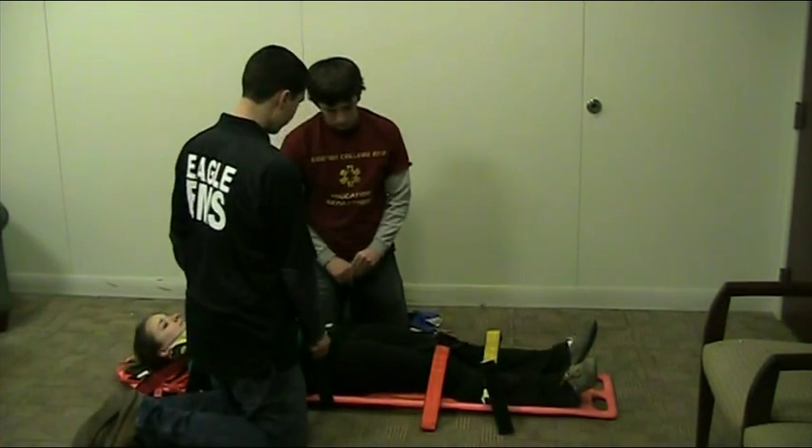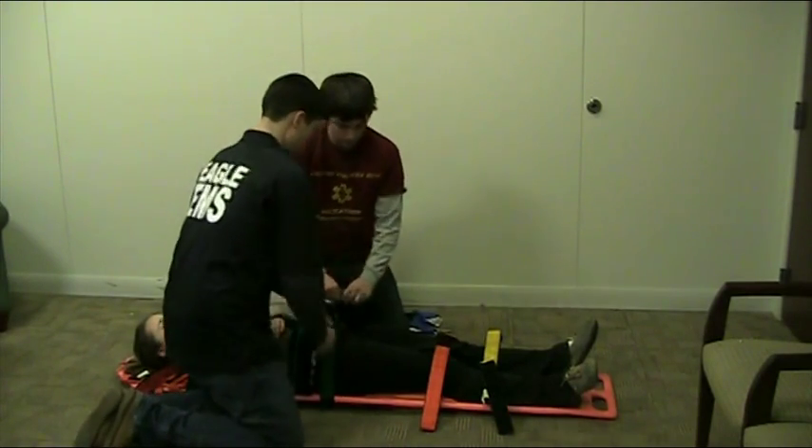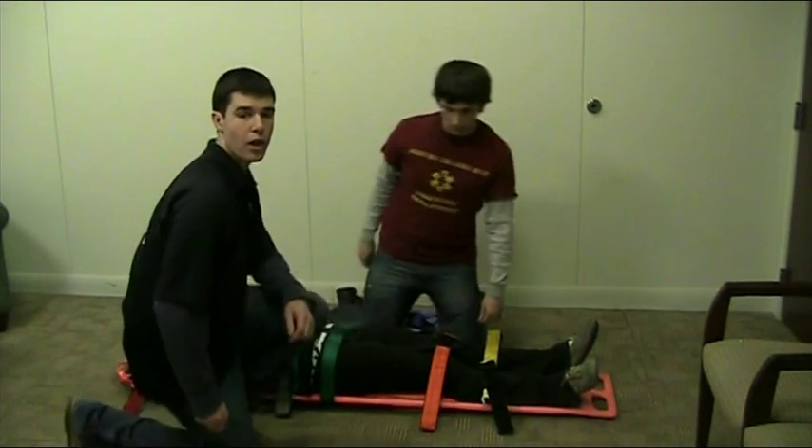As a unit, pull on the strap — one, two, three — and strap in. Do so for the rest of the straps.